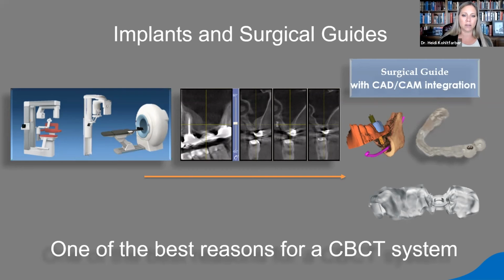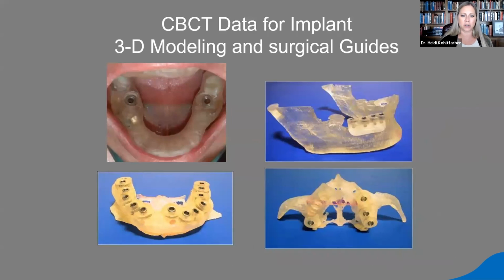It's going to decrease the amount of time it takes you to place that implant. And it's going to come with a nice recipe to tell you what drills to use. It makes it a little bit more foolproof for you, and it kind of takes off some of that stress and anxiety. Now, of course, the surgical guides can also be 3D printed.